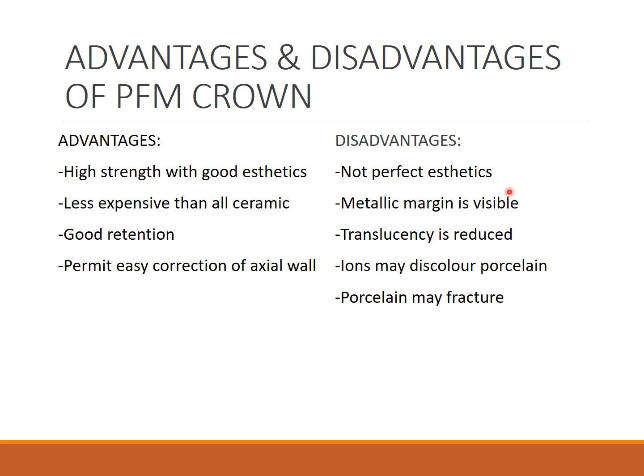If you want a perfect one, you have to go for an all ceramic crown. Metal margins are visible some of the time. Translucency is reduced, definitely, because inside there's a layer of metal and it may discolor the porcelain. Yes, the porcelain may fracture.